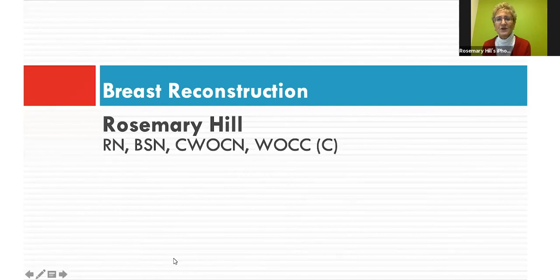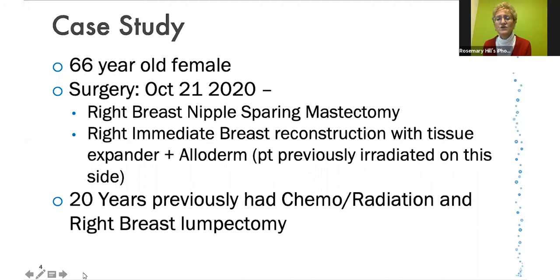So we're going to jump off this session actually right away with a case study. And it's a very recent case study, really impacted a patient of mine, and it was related to a surgery of breast reconstruction where there had been a reperfusion injury. And we needed to see what we could do to enhance the blood flow to this area.